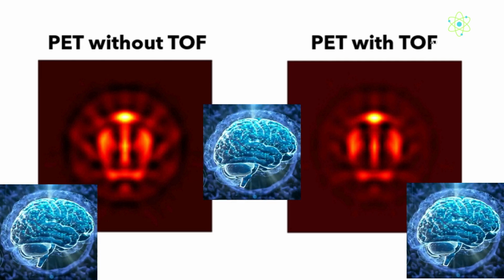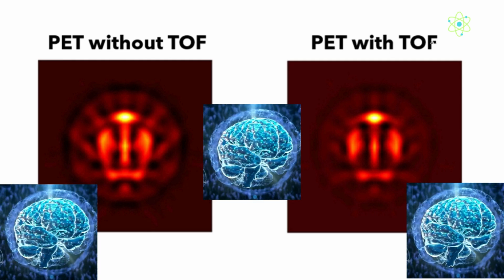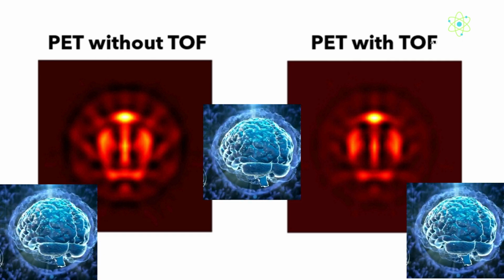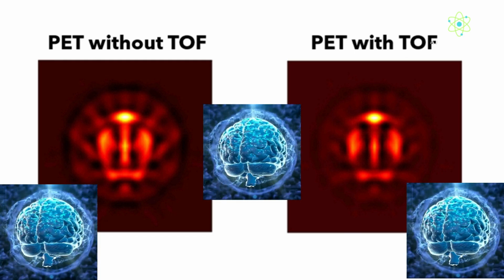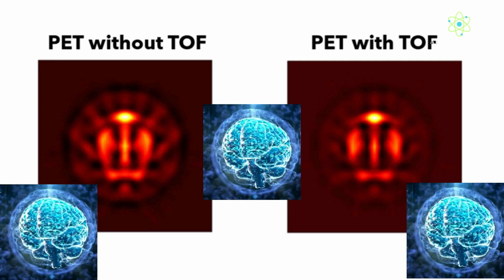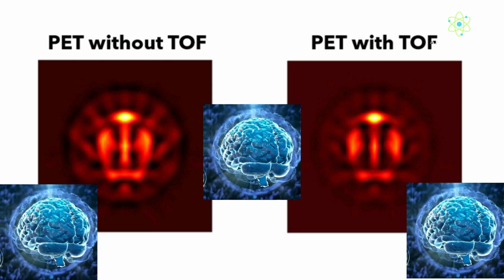The intensity scale ranges from 0 to 4, but the image is less clear and blurred, making it harder to identify and locate lesions or abnormalities. This can be a limitation in clinical settings for diagnosing and evaluating conditions like cancer.